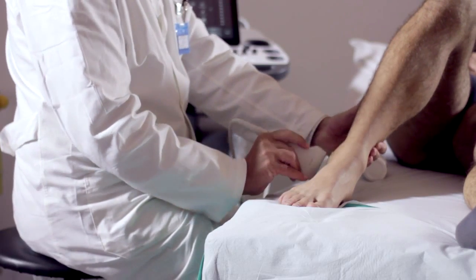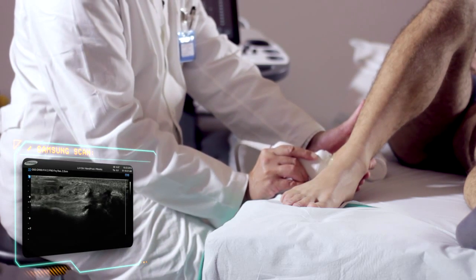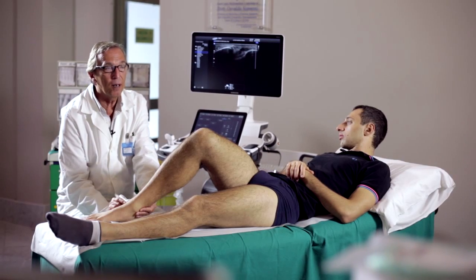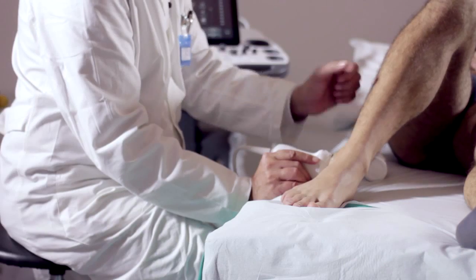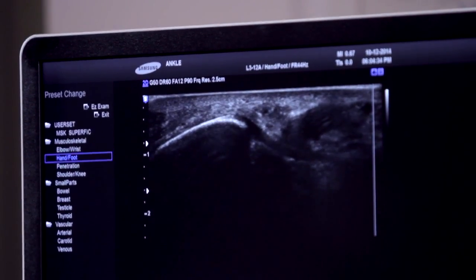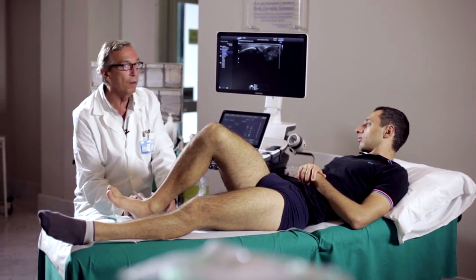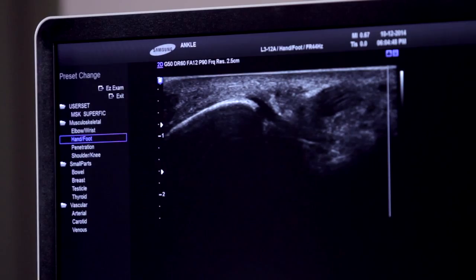We have to make a dedicated scan, including a plane that starts from the apex of the lateral malleolus and goes on the back up to examine the oblique course of this ligament. It is easier to highlight it by putting it in tension, while inviting the patient to flex the ankle dorsally in this manner. In this way, it is possible to highlight it correctly, as we see it very well in these pictures. This movement compresses and displaces toward the superficial layers two of the major tendons of the lateral compartment, known as the peroneal tendons.